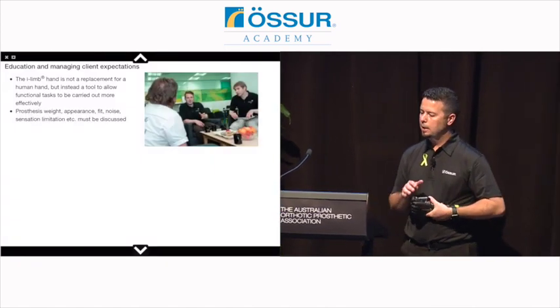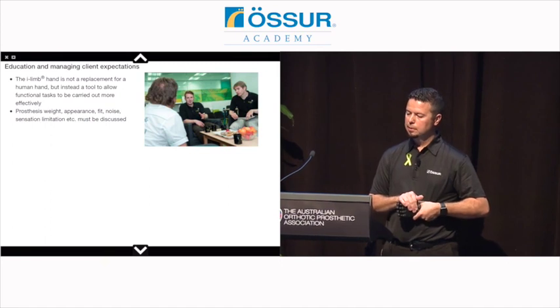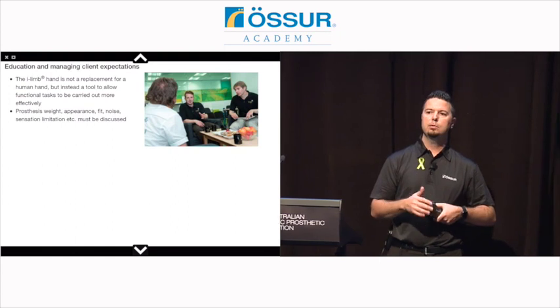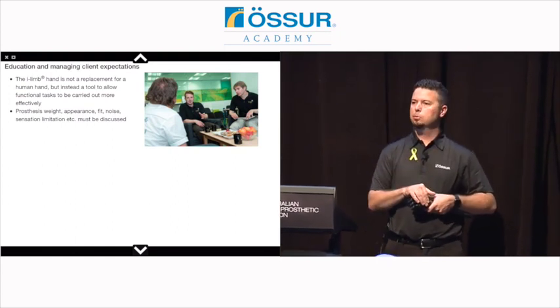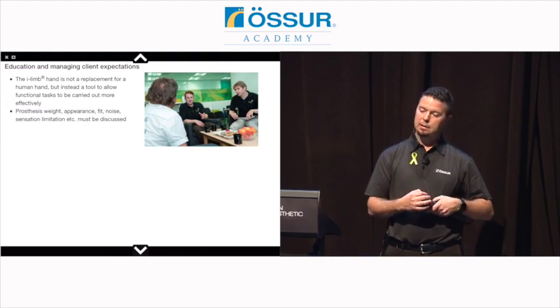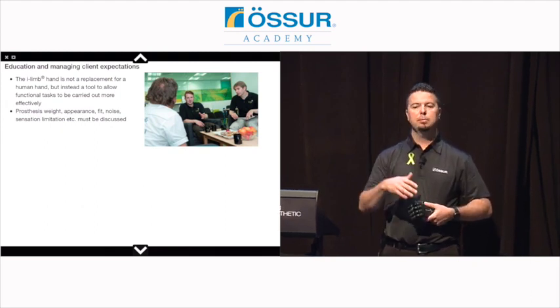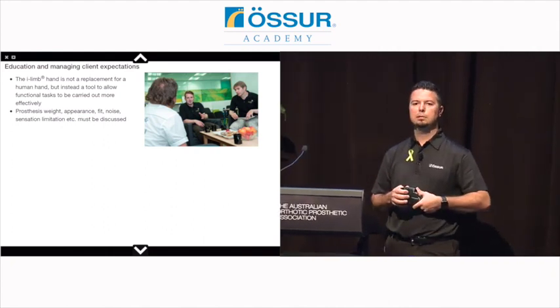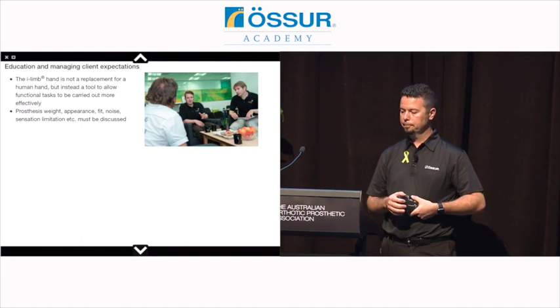We also say the iLimb hand is not a replacement for the human hand. It's amazing technology, but it is a tool. And sometimes with upper limb, you're going to have multiple terminal devices to be able to get that person through everyday life. This might be the hand that they use for 80% of their activities, but they might need a different device for something, a task-specific device, or maybe there's another device that they need as well.